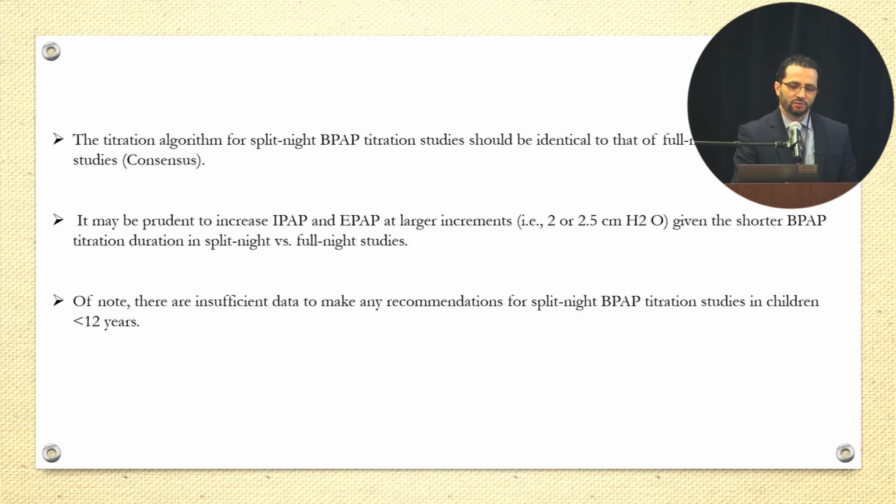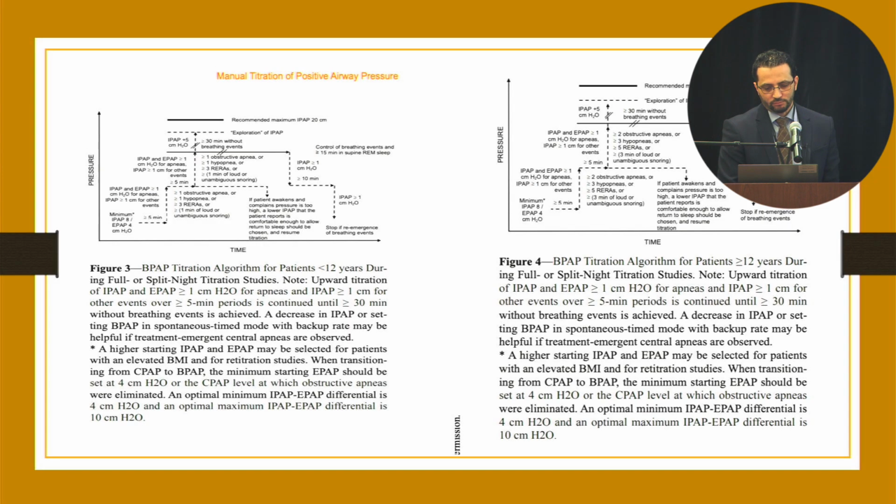Then the algorithm for the split night PAP titration should be the same as the PAP titration studies. If possible, maybe you need to go with the higher levels, or maybe you need to switch your pressures more than just once because of the short time in a split night sleep study. This is also from the guidelines, and you can print this and put it in front of you.